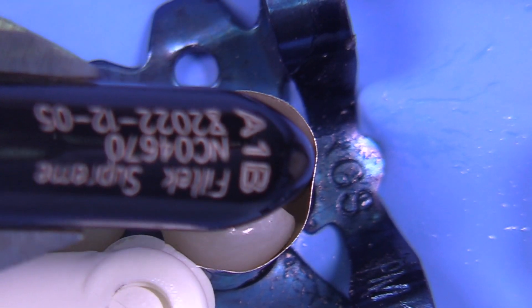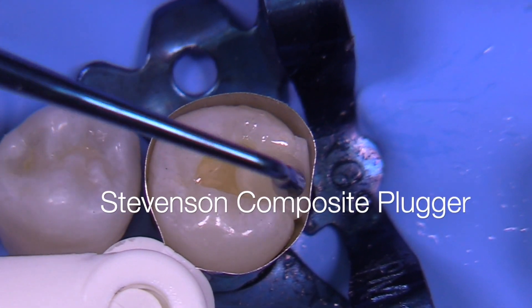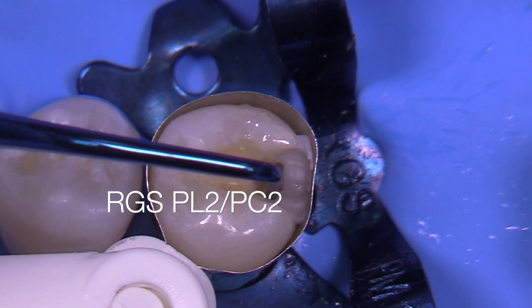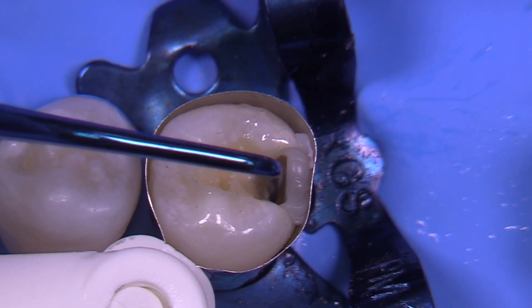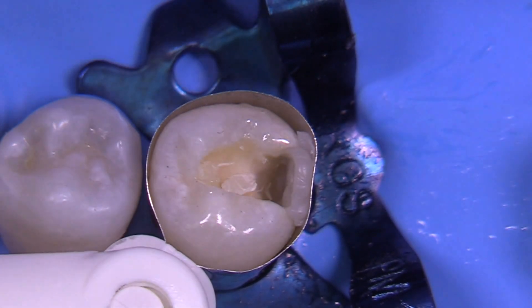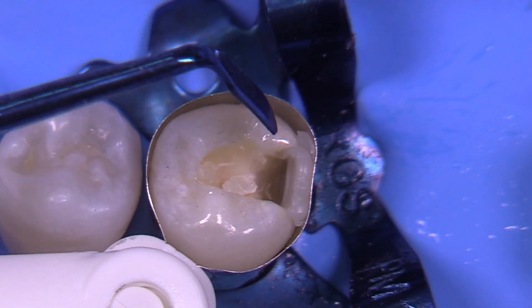You can use basically whatever product you think is best for your practice and your patients. Now you don't need a sectional matrix in this particular case — if we were working interproximally we would, but because we're going to have access to contouring the interproximal areas we can use a simple Toffelmire-type retainer. I'm now going to introduce these new composite instruments: the PL2 and the PC2. This is a titanium nitride coated instrument — I've had them coated in blue because I dig the color.